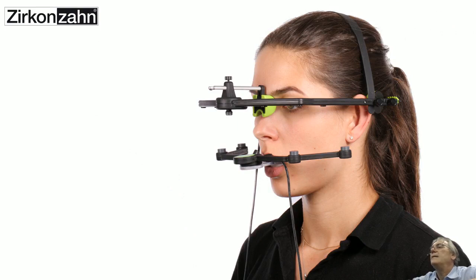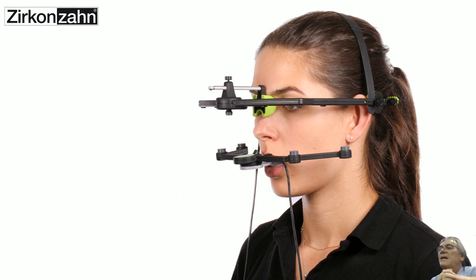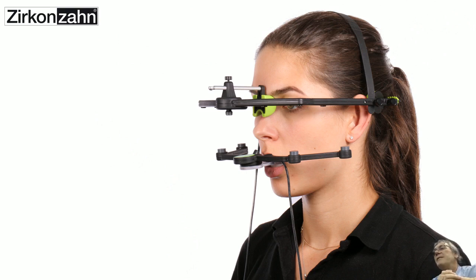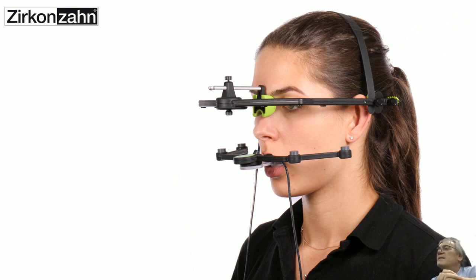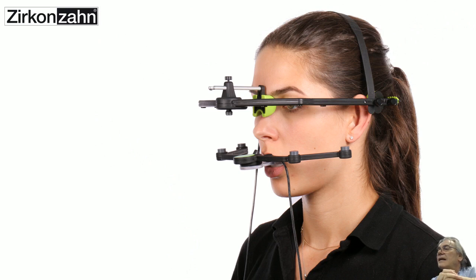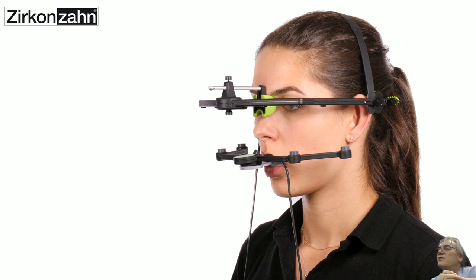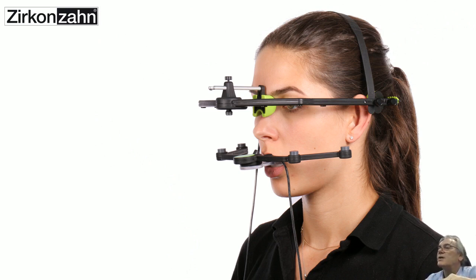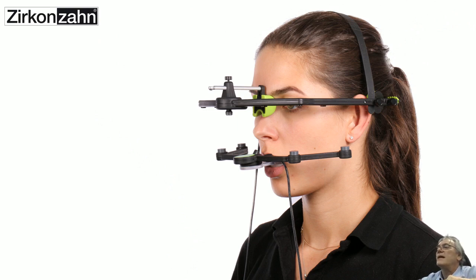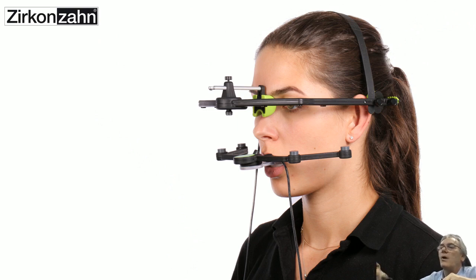And as the cherry on the cake, there is the plane analyzer, which is basically a pantograph by means of which we capture individual intraoral recordings of the patient's movements and utilize this data to set our articulator.